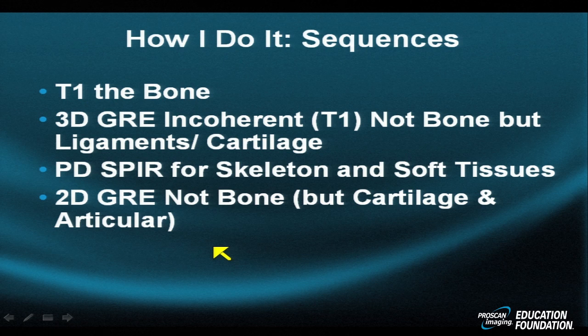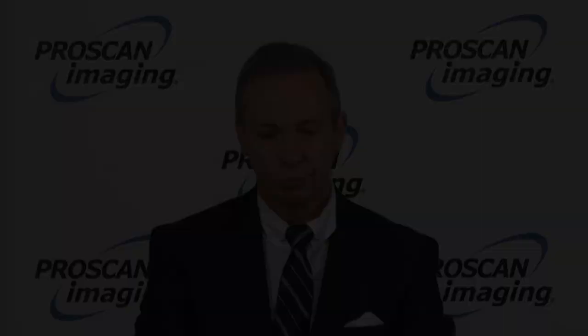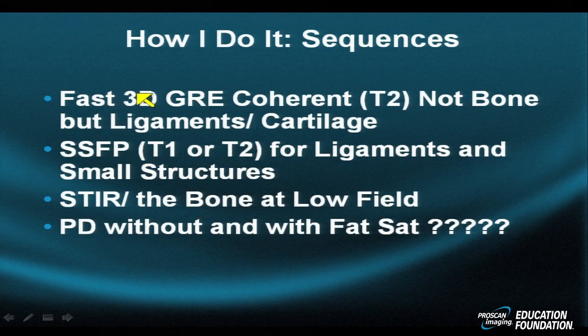The 2D gradient echo sequence — identifiable by 'GRE' in the corner of the image — shows bones and muscles appearing slightly shiny. This sequence is often performed with water emphasized so that the interface between water and cartilage is highlighted. It is used to look at the intra-articular space for loose bodies, hemosiderin, chronic blood, and to assess the cartilaginous surface for erosions and their thickness.